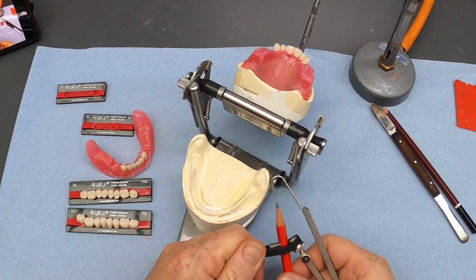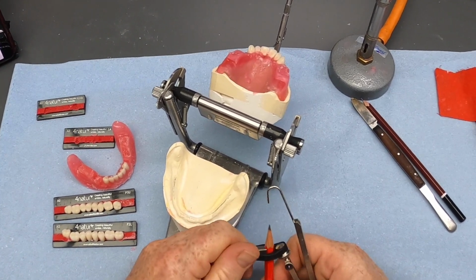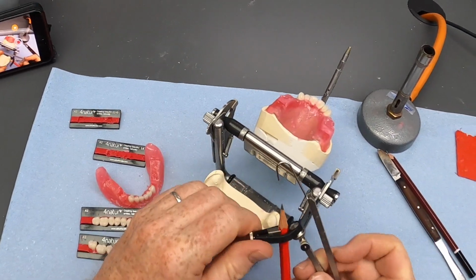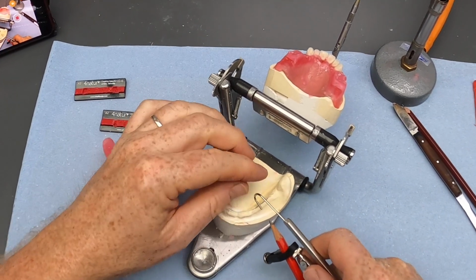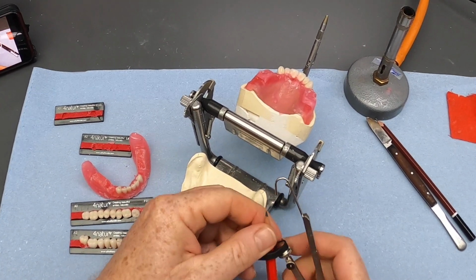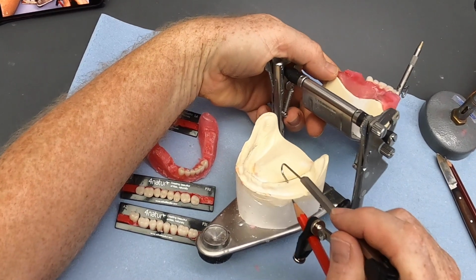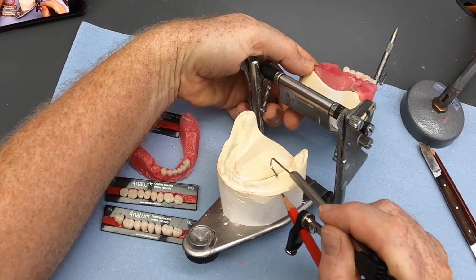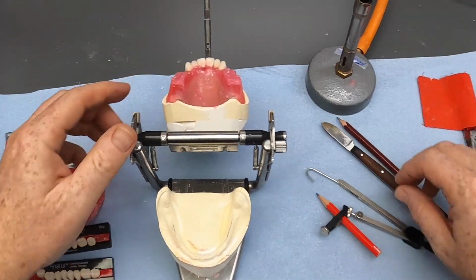So we can just pull the pencil back a touch. We can scribe the contour of the alveolar onto the side of the model, and that can help us determine where we want the lower six to be placed. I don't often do this, to be honest, but it's recommended by some. So we can take our compass and we can scribe the contour, and we can see where the dip is and position our tooth in about that point.